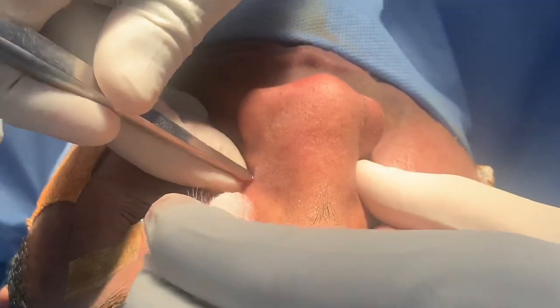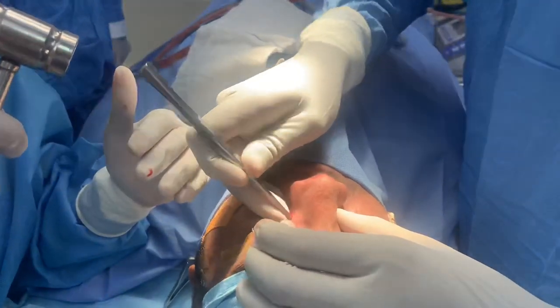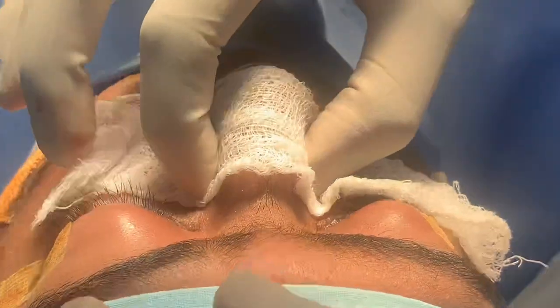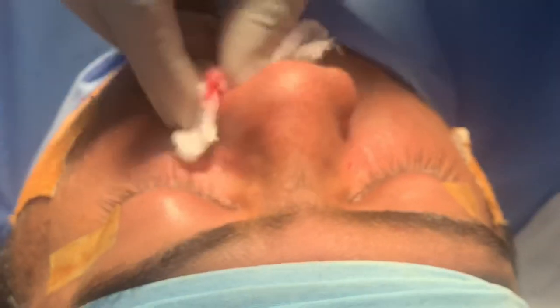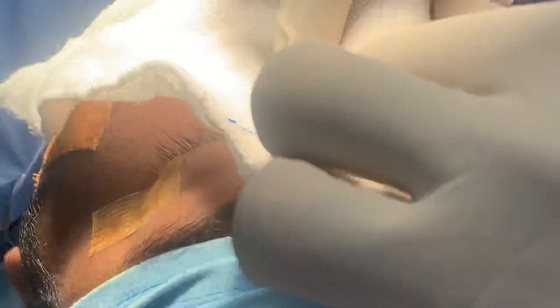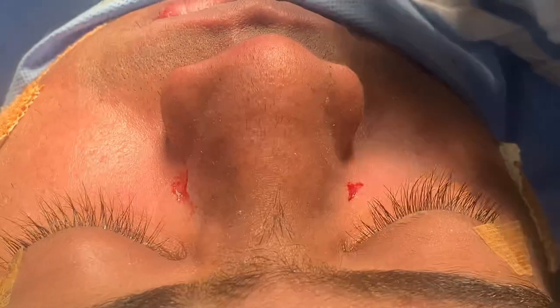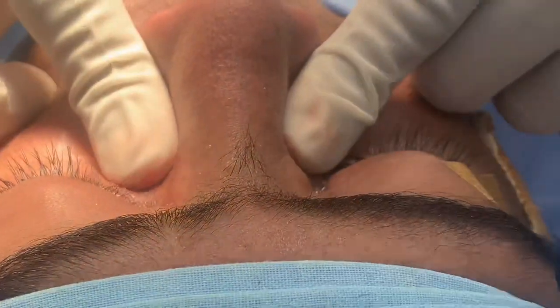The two stab marks are for the osteotomy. I'm doing osteotomy to reduce the width of the nose — this is a closed rhinoplasty. I've already done the other side. The width of the nose is coming down — it's probably moved in by two to three millimeters. We're not expecting great movement; we just want a subtle movement. You can already see it's moved a bit, so there's no bone now — the soft tissue will adapt itself, giving a much narrower dorsum.